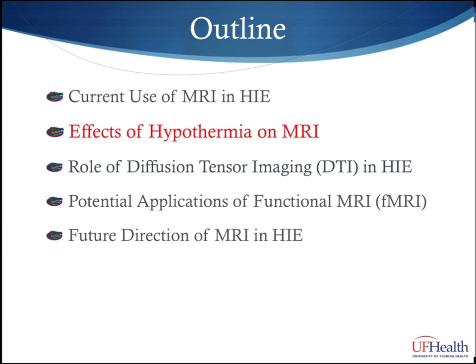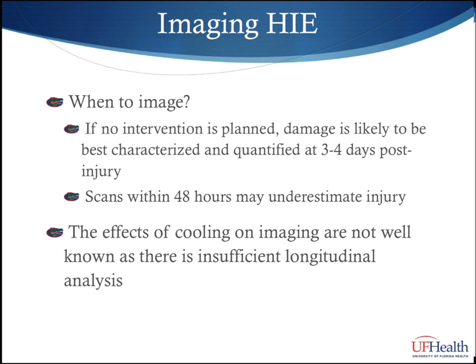So now I'll briefly discuss what we know about the effects of hypothermia on MRI. Unfortunately, there's little longitudinal data to help assess the optimal imaging time, but we can extract some information from a combination of other studies to help us decide a potential optimal imaging time. So when should we be imaging?